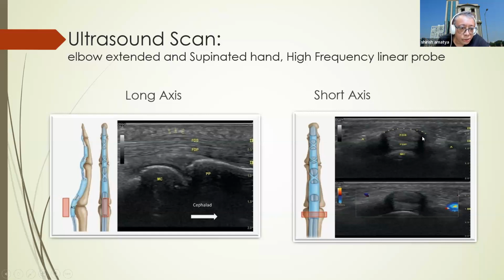And the pulley is not only the roof; in the lateral aspect of the flexor digitorum superficialis and profundus, you can see a triangular-shaped black anechoic area. This, along with the upper arch, is the A1 pulley.